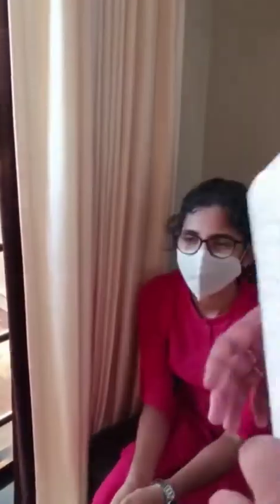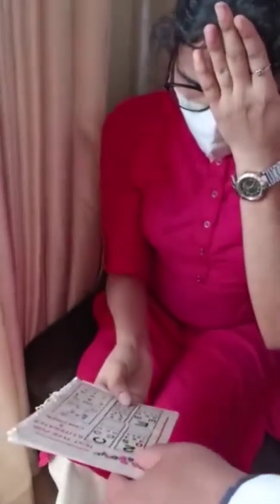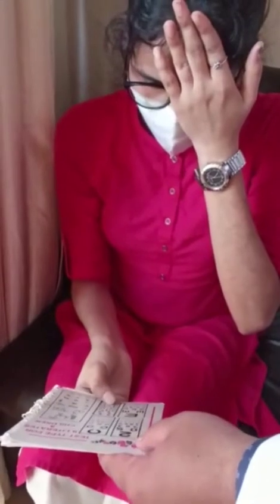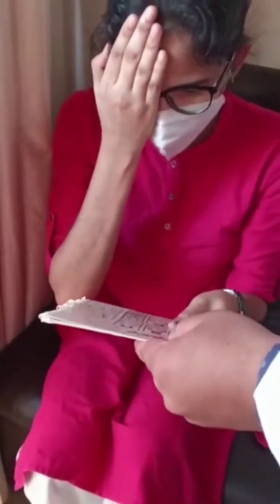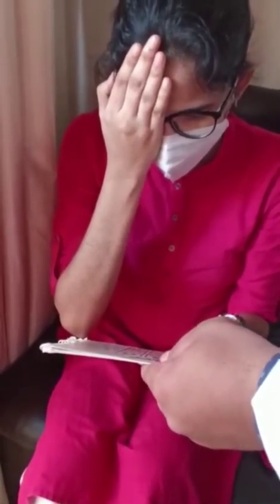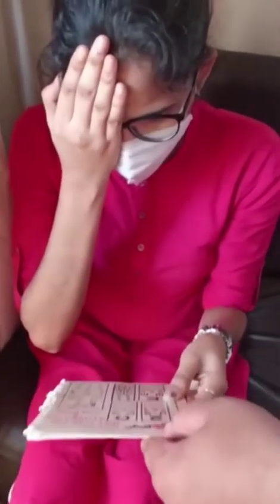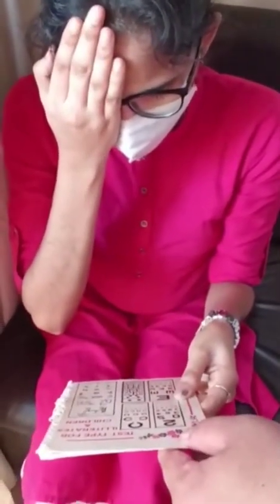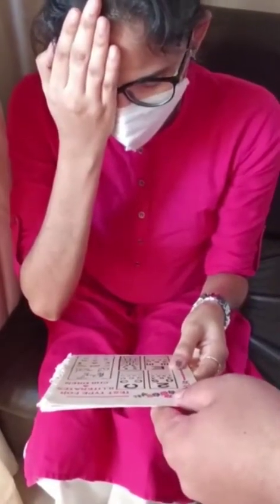Okay, we'll check near vision now. Up to here you can see. 2, 0, 5. Next. That's all? Check your other eye. 2, 0, 5, 3, 6, 4, 4, 9, 5, 2, 6, 0, 4, 9. Next, I can't do it. Okay.